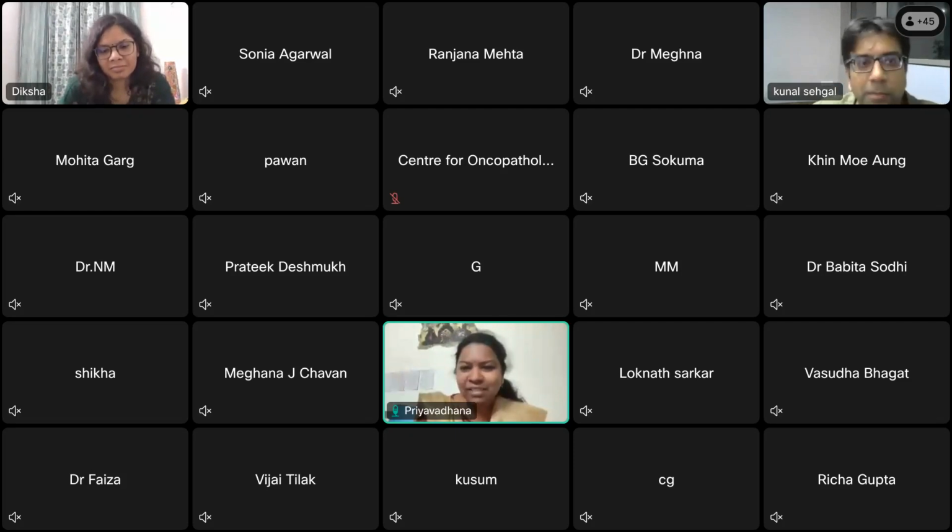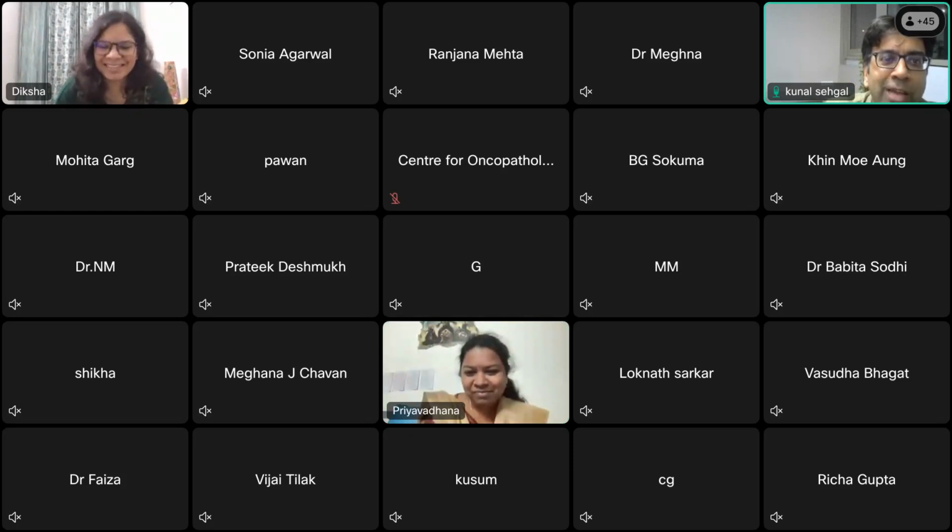Also please go to your lab and see what slide review criteria you're following. Yeah, I would like to add, it's a crime to see a slide without seeing your graph and CBC printout or photo. Please do not do it for any case. I would rather have you see the CBC histogram and graph and not see the slide, because half-hearted seeing of the slide is of no value. So I would suggest doing it always for every CBC.